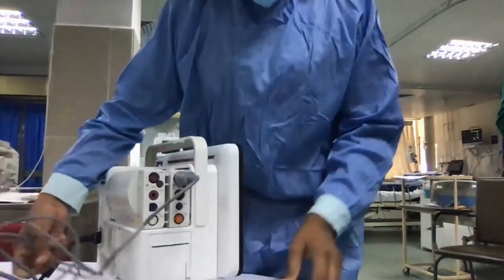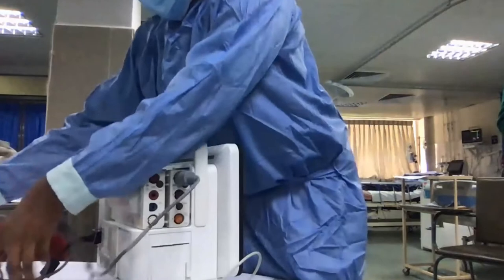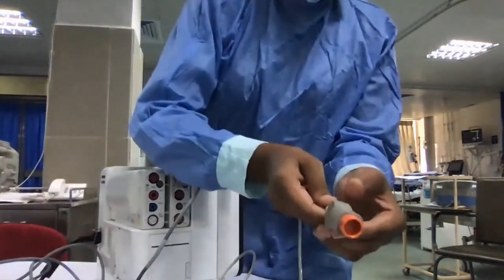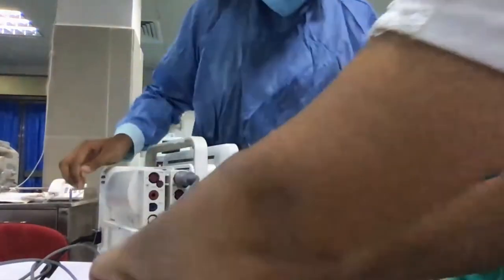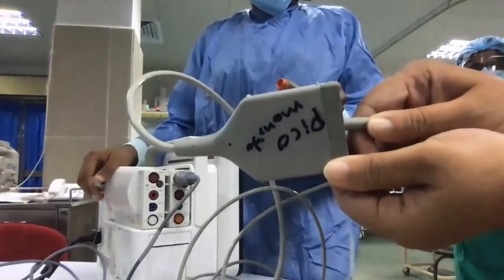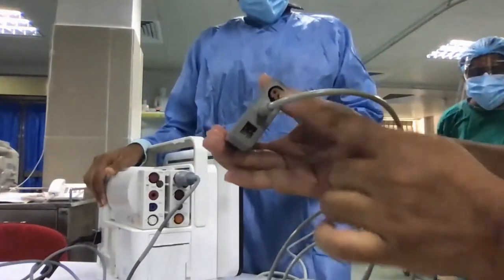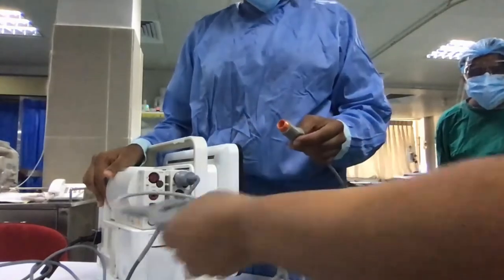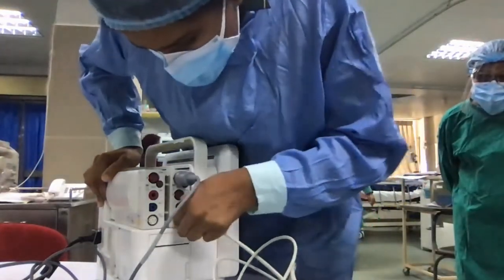Now we have connected that, and I will connect the cardiac output cable as well. So this is the cardiac output cable, the orange color one, which goes and connects to this box over here. This is the PiCCO monitor's main unit that receives all the wires, and the temperature sensor as well. So you can connect the cardiac output cable like this.